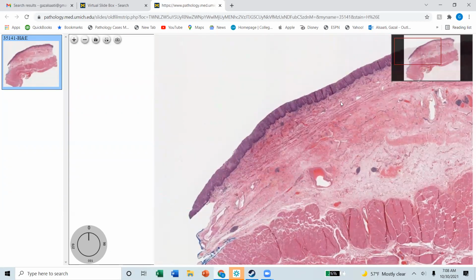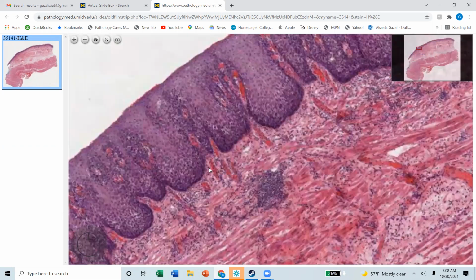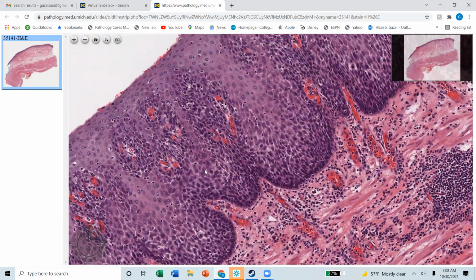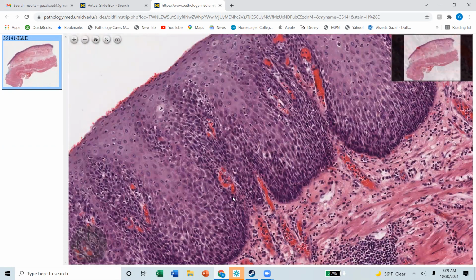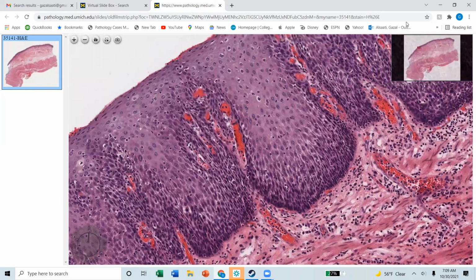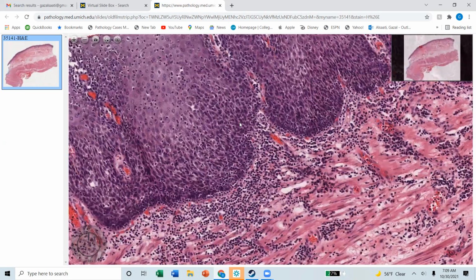What does that mean to our surface epithelium? If we know from the patient's history that the patient has achalasia, I will look for three things. Reflux change, which the patient has here. He actually has the whole shenanigan. Increased lymphocytes everywhere. Papillomatosis, 1, 2, 3, 4. Papillomatosis is just that the squamous papillae will almost reach the top. And spongiosis, basal cell hyperplasia, the whole thing. And they have a lot of increased lymphocytes, as you can see.